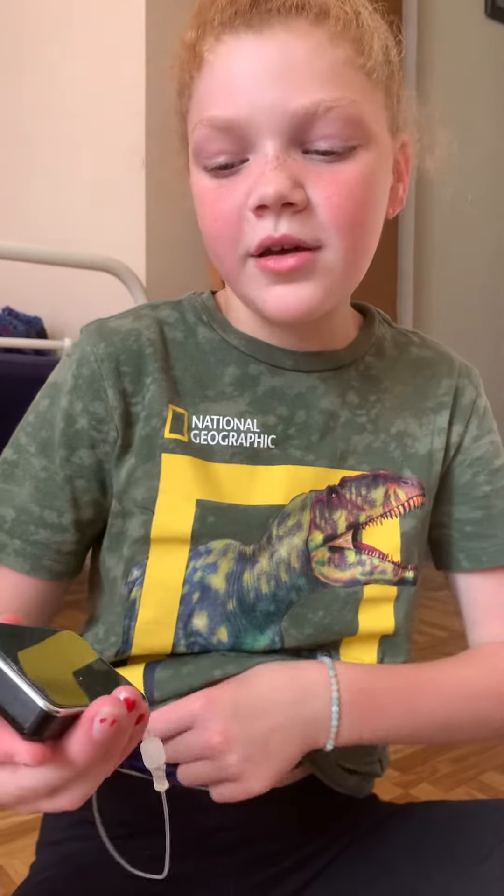This is my pump. I'm so sweaty — my pump band's sticking to me. My pump is this little thing. It's a little cracked, but I have a new one. This is my pump.